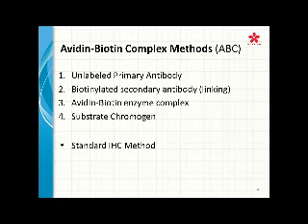This is a very standard immunohistochemistry detection system. Because biotin binds to avidin with extremely high affinity and very high specificity, the avidin-biotin enzyme complex binds and makes the reaction much more sensitive.